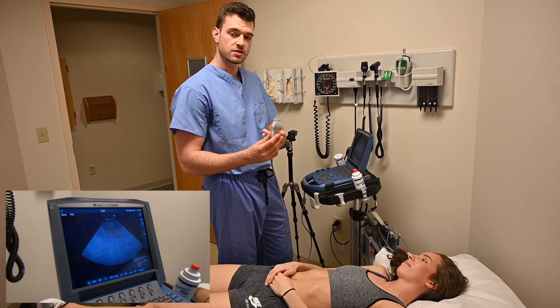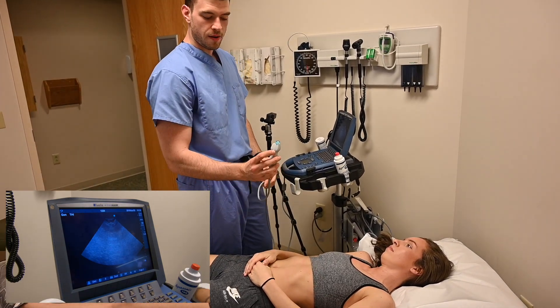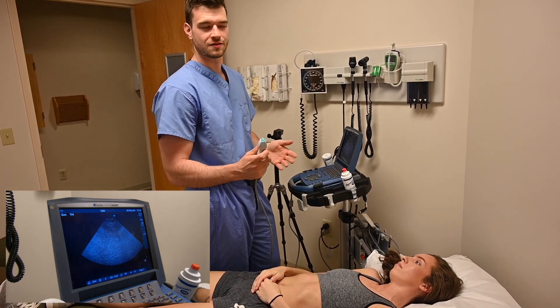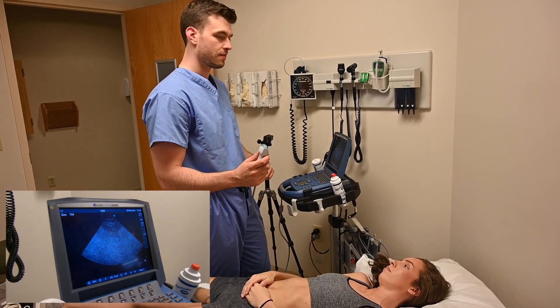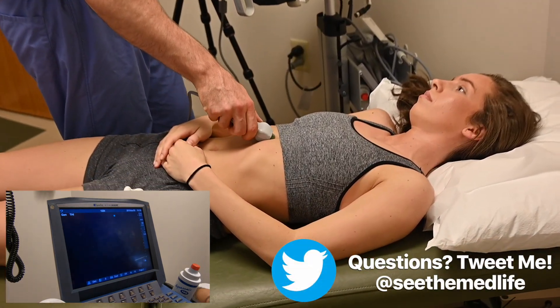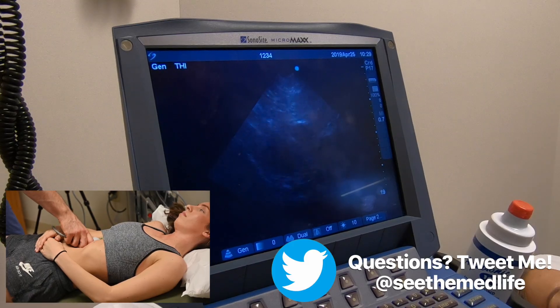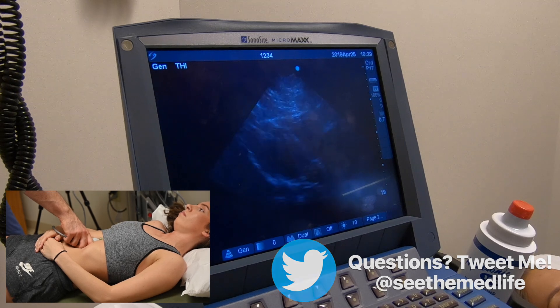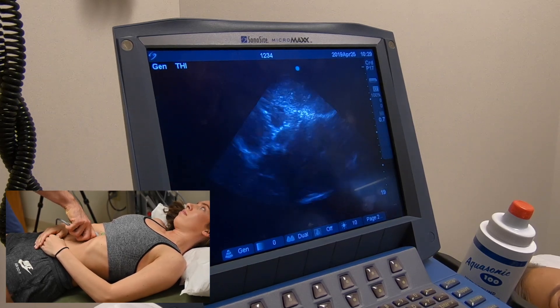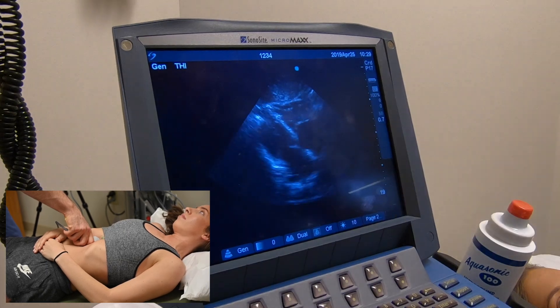I've switched to the phased array probe, which gives the deepest penetration to see the cardiac view. For this I'm going to point towards the right side, though there is debate between emergency medicine and cardiology on probe orientation — cardiology goes left for a traditional echo. We do the same sub-xiphoid approach with a little pressure, and there is Stephanie's heart. Take a deep breath and hold it — and we can see a four-chamber view. We can see the valves and all four chambers clearly.